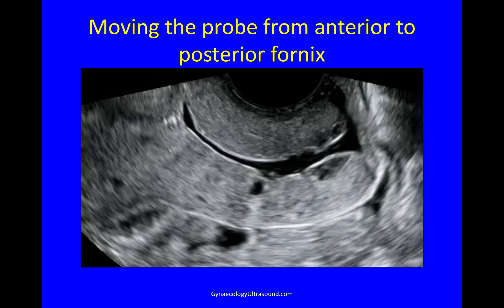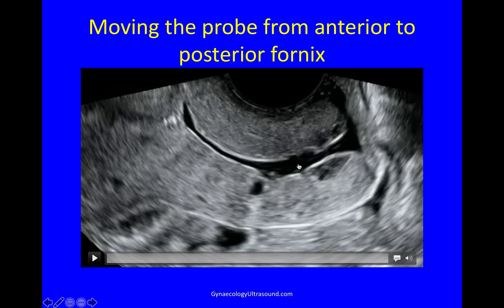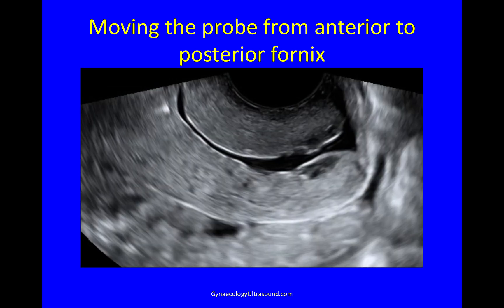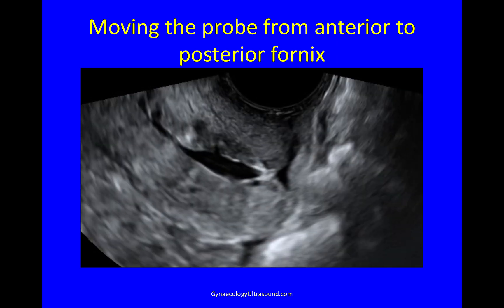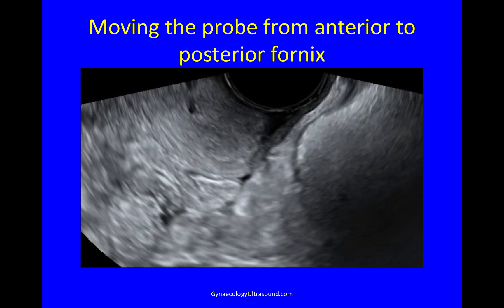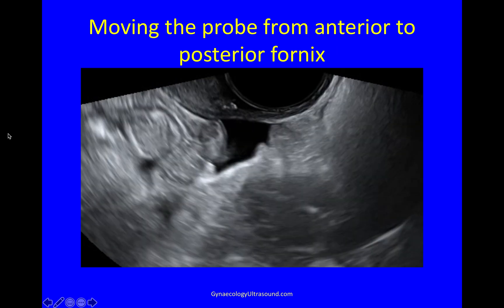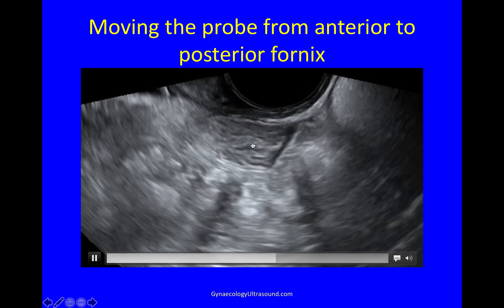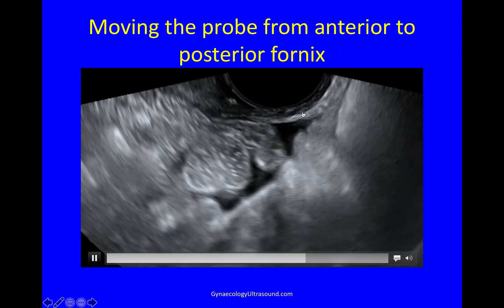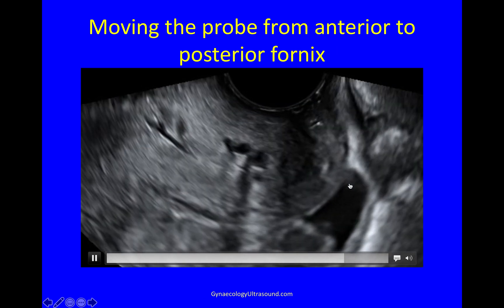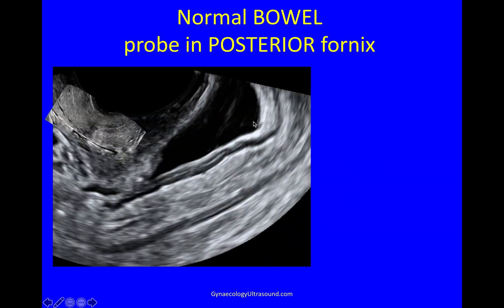Next, we look at bowel. To look at bowel, you need to be in the posterior fornix. A lot of ultrasound is done through the anterior fornix; we need to withdraw the probe a bit and angle it backwards into the posterior fornix. This is the external cervical os, this is some mucus in the canal, and this is the internal os. I'm going to very gently withdraw the probe a little bit and angle it backwards toward the sacrum, then very gently insert it while saying to the patient: let your knees go floppy and your bottom sink into the bed. And you can see there the posterior fornix where it attaches to the cervix, some fluid in the pouch of Douglas, the utero-sacral ligaments stretched over the posterior vaginal fornix. There is the peritoneal reflection. When you're in the posterior fornix, you know where you are because you've pushed the whole uterus out of the way.